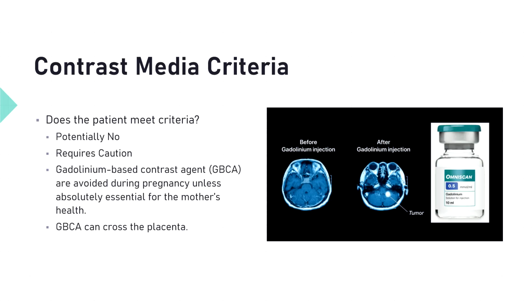For the contrast media criteria, the most critical obstacle is the contrast media. Does the patient meet the criteria? Potentially no, and she requires caution because even though Miss Jane has no known allergy or kidney issue, she's pregnant. Current ACR guidelines state that gadolinium should only be used during pregnancy when there is an overwhelming clinical need that cannot wait until after delivery, because the gadolinium molecule can cross the placenta. So we must be extremely cautious using it with a pregnant woman.